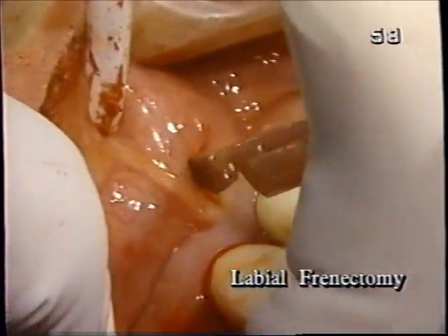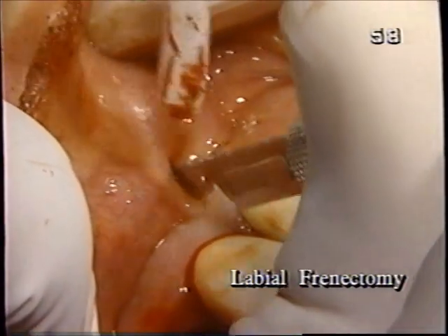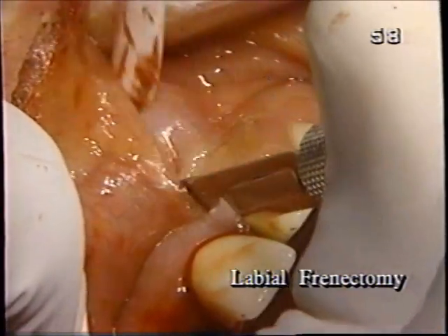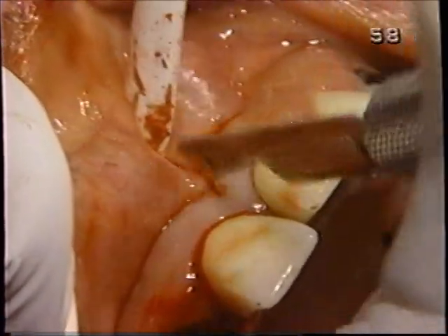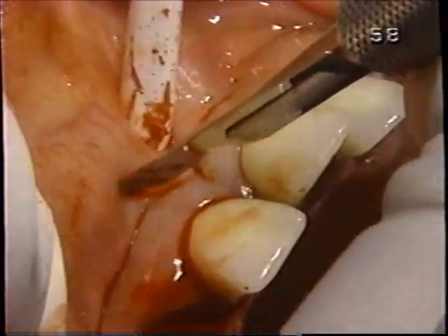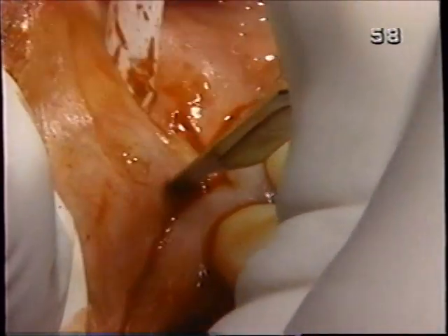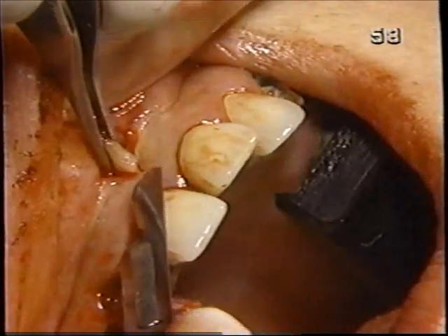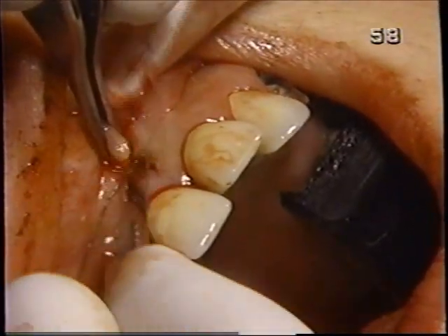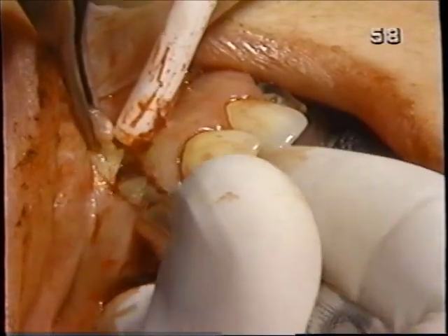Okay. We'll go ahead and make about a centimeter long incision right here. You know, I think the scalpel is getting dull already just from what we've done, and it's not uncommon to need to change it. We've made a linear incision on either side, and now right against the periosteum.